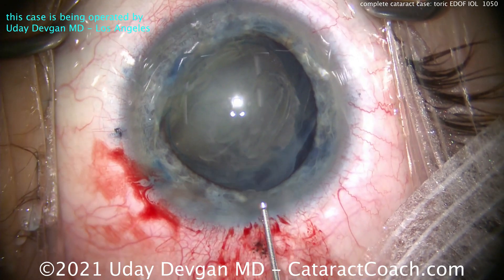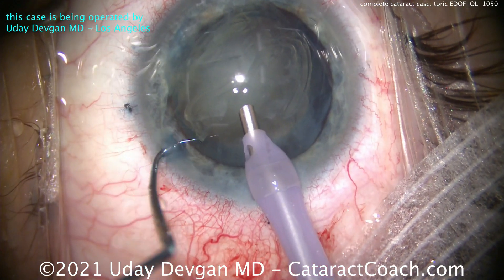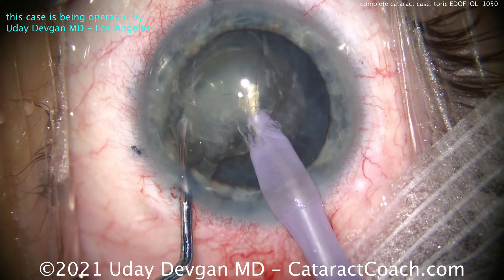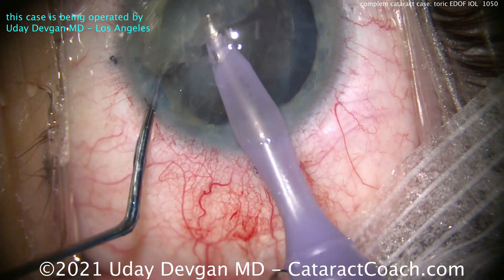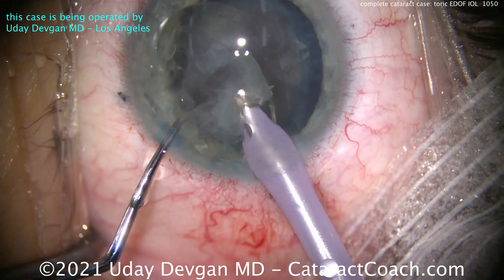We're recoating the endothelium with that viscoelastic, and we can put the phaco probe in the eye. This should be relatively easy to aspirate. There's the densest part of the nucleus which we go into first — use the chopper and chop that into smaller segments, break it apart. The epinuclear shell, which is relatively large in this case, is also going to be pretty soft, so that'll be easy to aspirate.